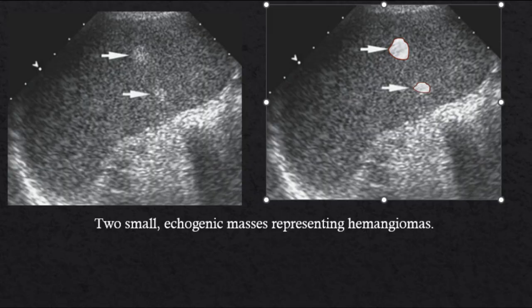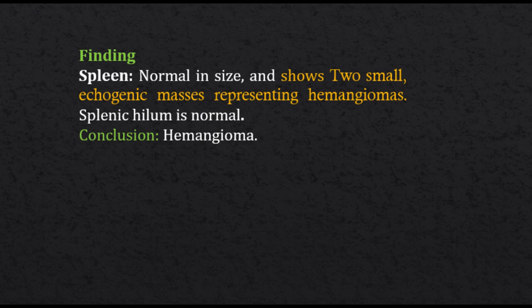Third case finding: spleen normal in size and shows two small echogenic masses representing hemangiomas. Splenic hilum is normal. Conclusion: hemangioma.